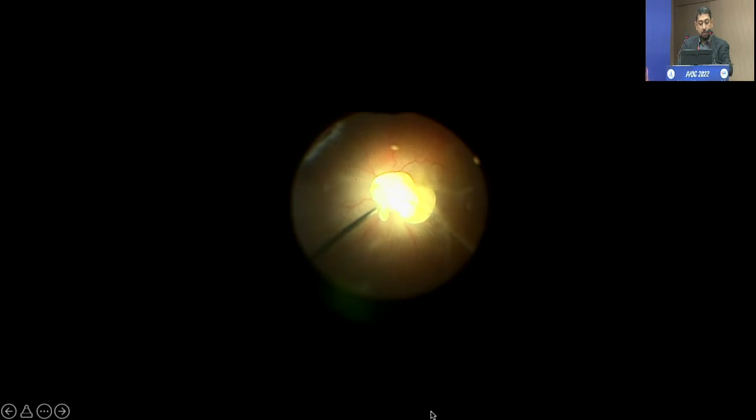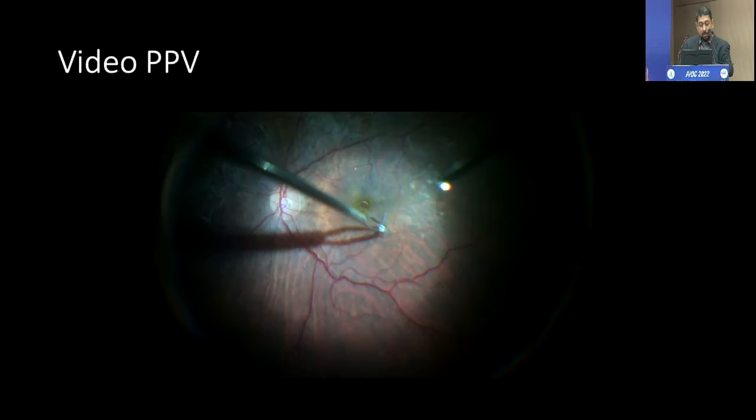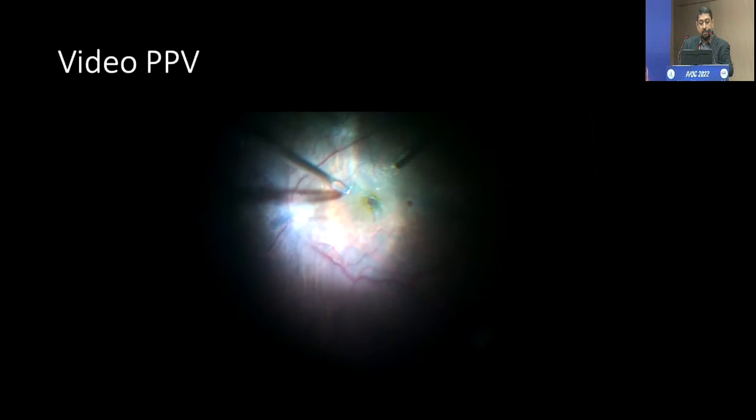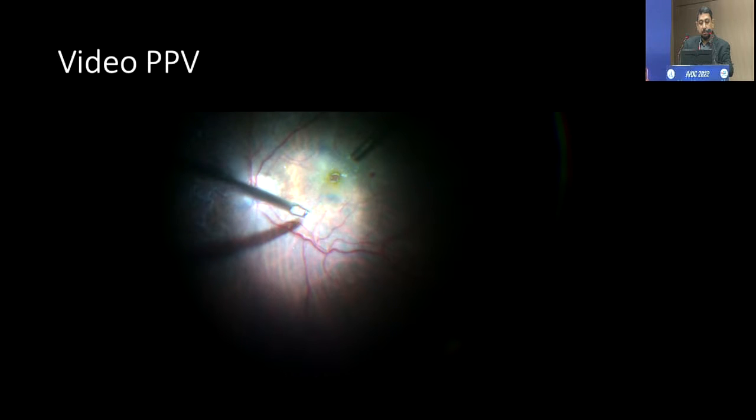The last slide is a quick one. This is another example of a double staining. You see there's a little amount of blue and a little splattering of IVTA. That's how you see all the membranes quite clearly. And this is a very useful way of staining myopic ILMs. You can see both the tissues are stained with both splattering of white crystals and blue.